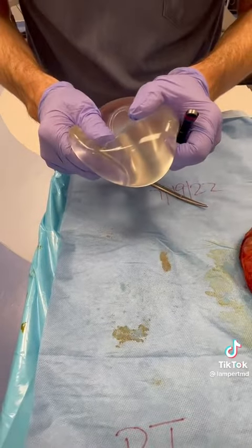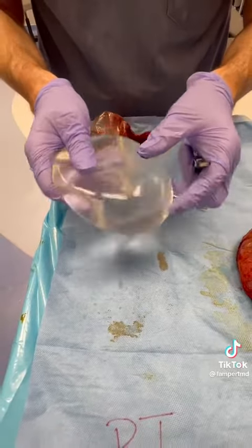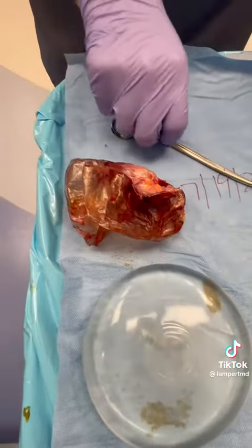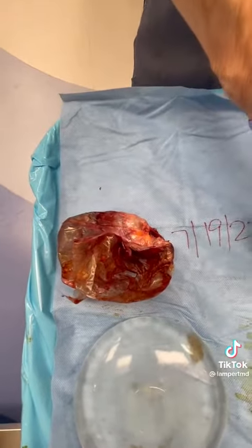I can't read the profile anymore, but it's a Mentor 450 on the right. We'll send this to Pathology. And then we're going to come over here now.